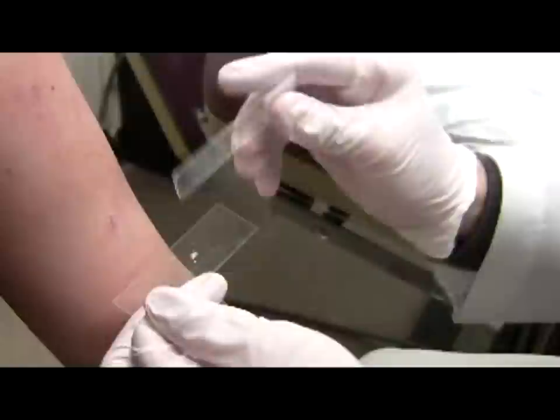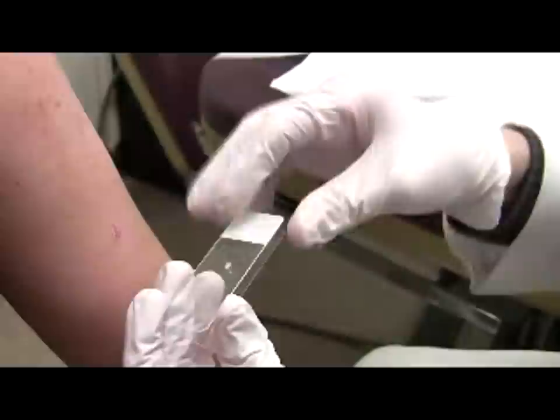If I sneeze or if there's too much air, it will blow all the scale away until you get to the lab.